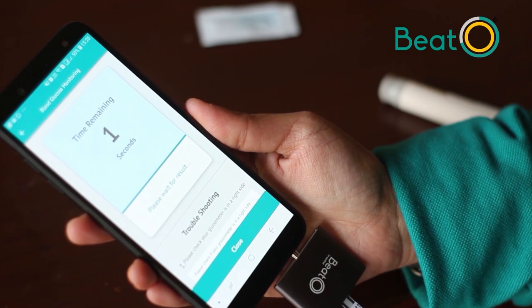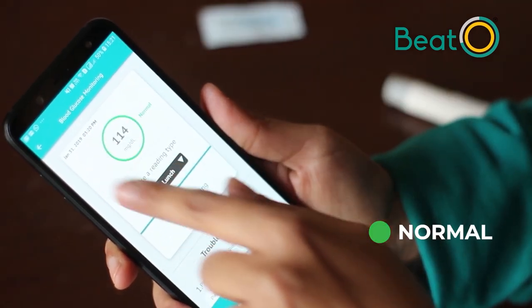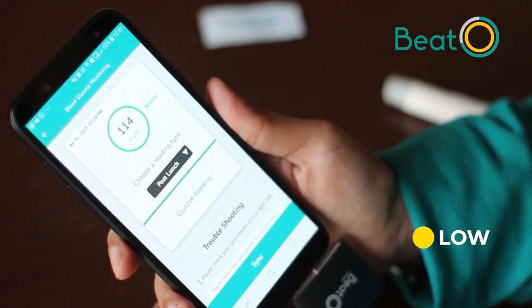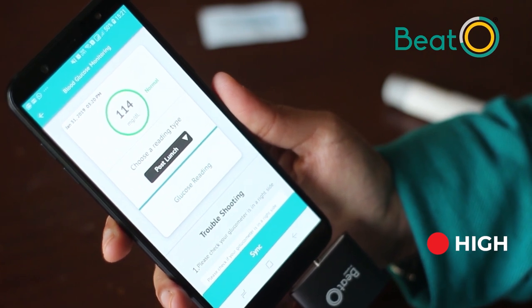Wait 10 seconds before your result appears. If your reading is in the normal range, it will show a green circle. A yellow circle indicates a low reading, and a red circle indicates that your reading level is high.